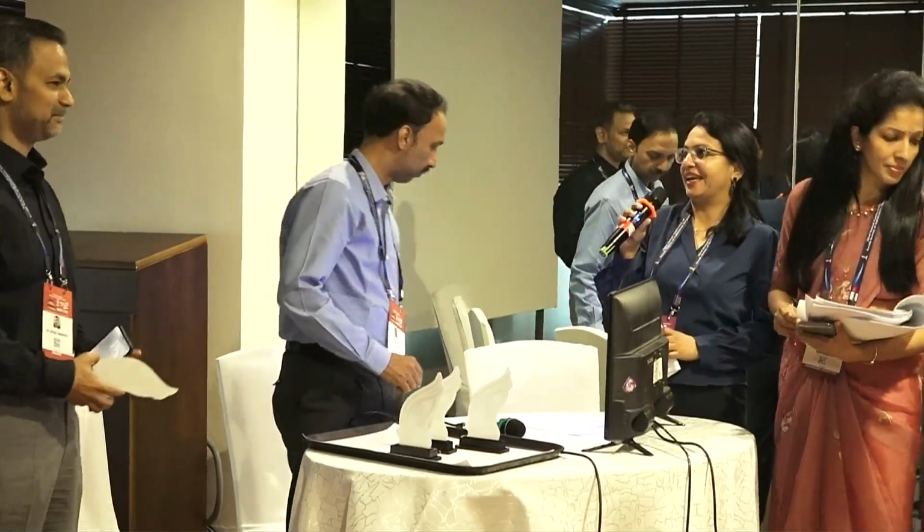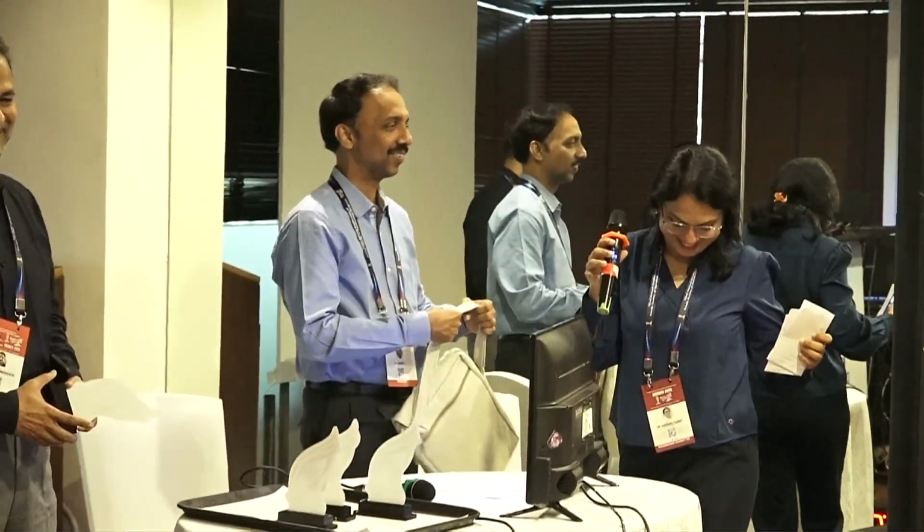One last question. When do we expect that the AI would sit in the OPD and tell us what to inject and when to call the patient next? In how many years?